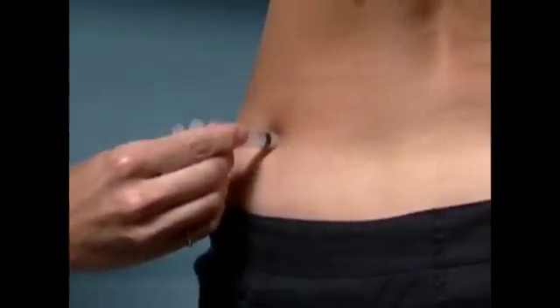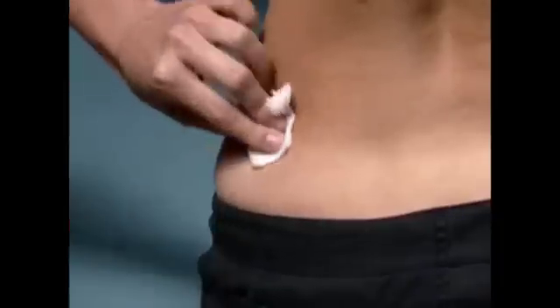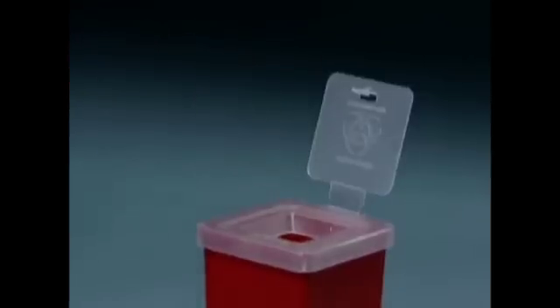Once the injection is completed, gently withdraw the needle and apply pressure to the injection site with a sterile gauze pad. Discard the used syringe and needle in your safety container.